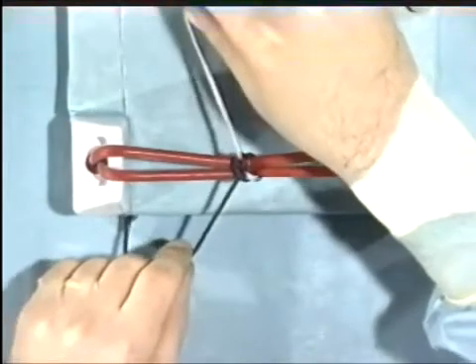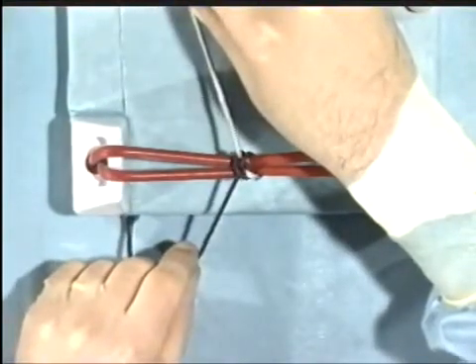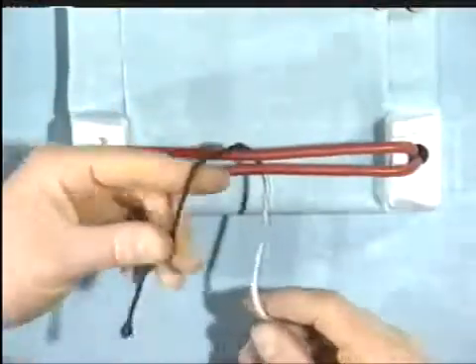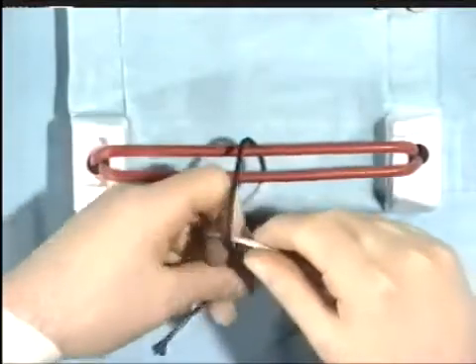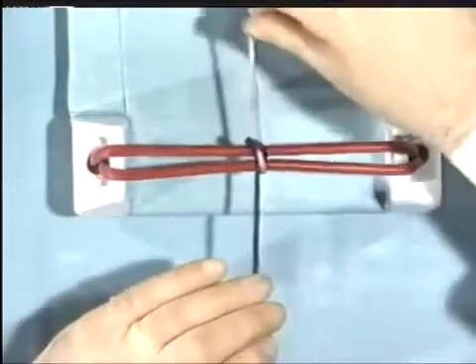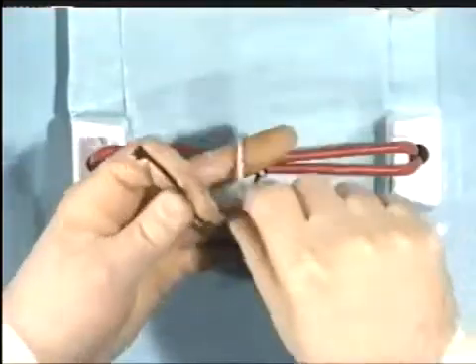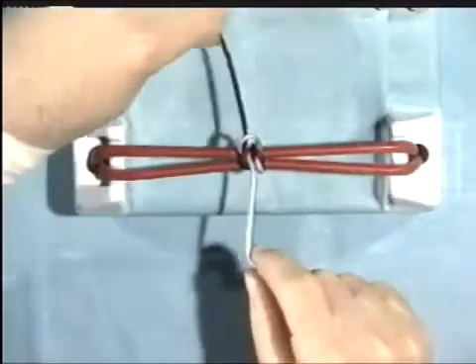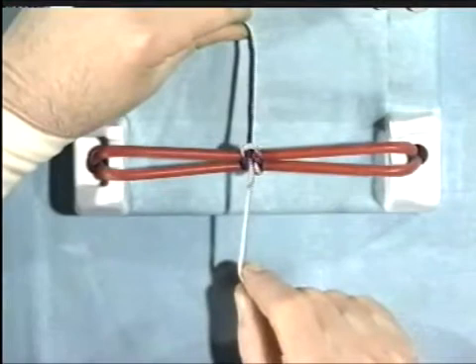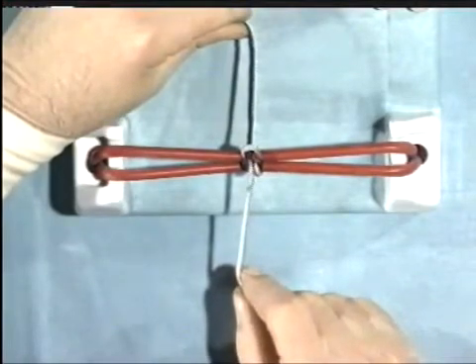Let's therefore remind ourselves of the correct way. Index finger knot, crossing the hands, middle finger knot, crossing the hands again, and here we see the reef knot.